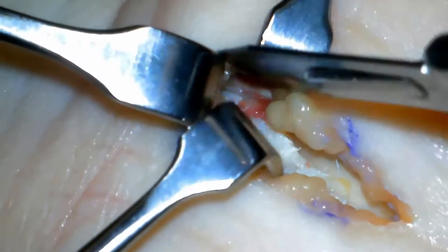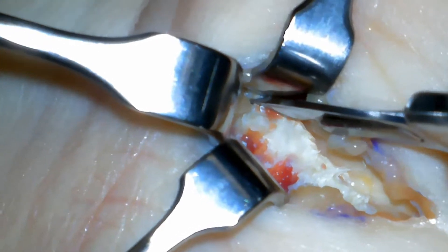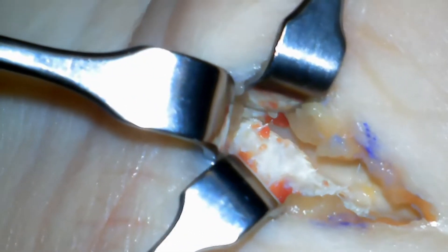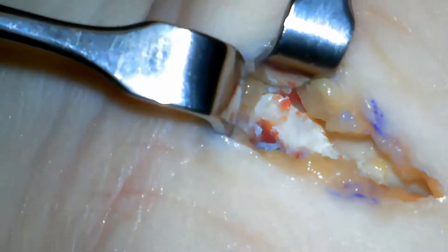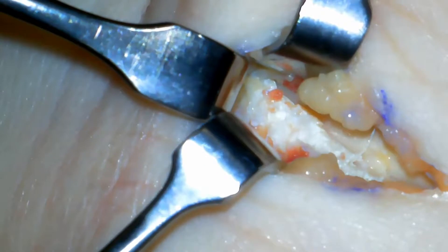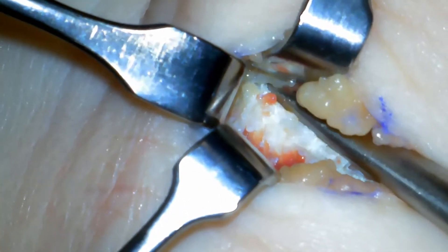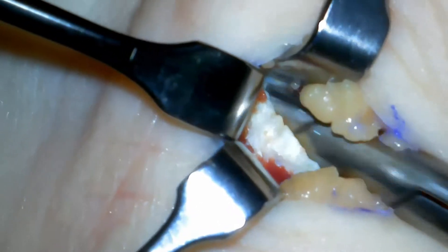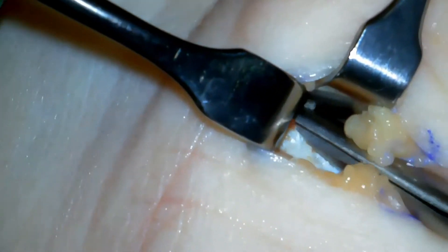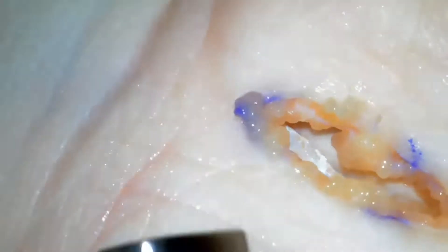The retractors are replaced and the knife is then used to cut the tightest part of that ligament. Lastly, the retractors are replaced and the larger scissors are used to create a pocket and then divide the last bit of tissue up into the forearm. We then use the tip of the scissors to bluntly feel that all of that tissue has been released.